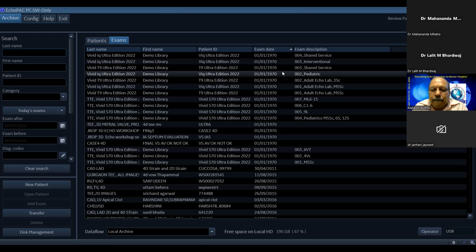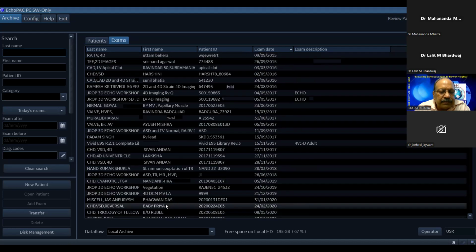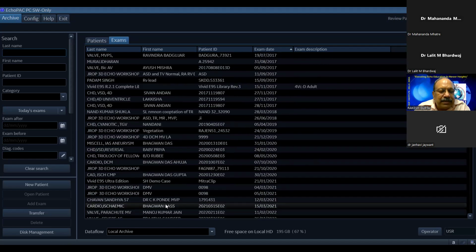So can you show once how to measure it again? Okay. What do you want to see? Color flow propagation velocity. So I have to look for an atrial fibrillation patient. Okay. You can see my screen, right? Yes, sir.